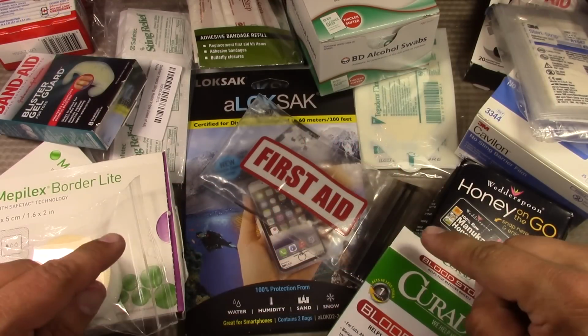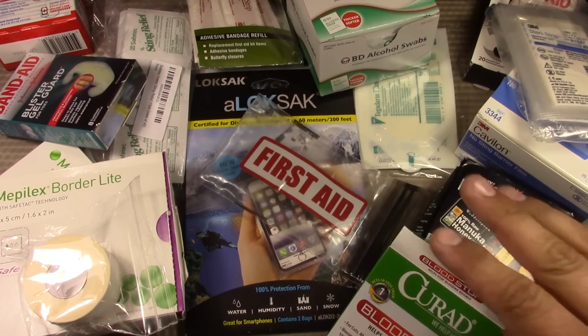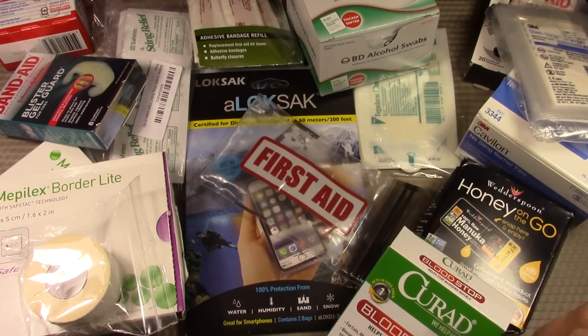Now that you've seen all the items that were included in that particular version of the Mini Medi kit, let's replicate that kit. We'll make 3 new Mini Medis, and then at the end of this video, we'll give them away in a quick little flash giveaway contest. Let's get started.